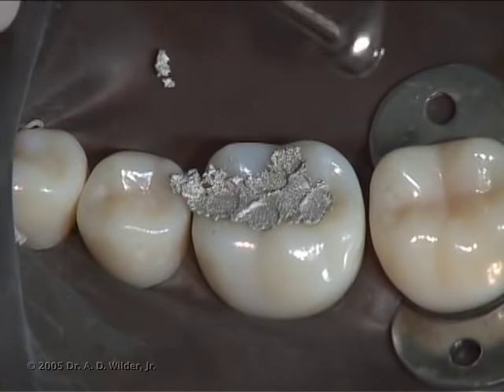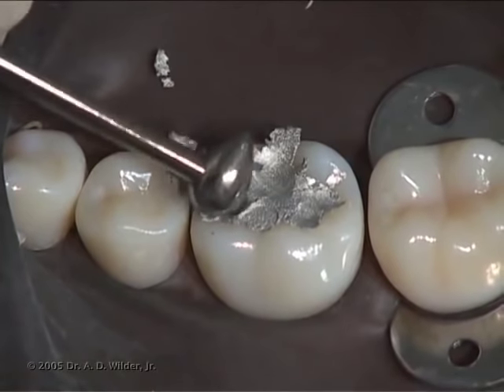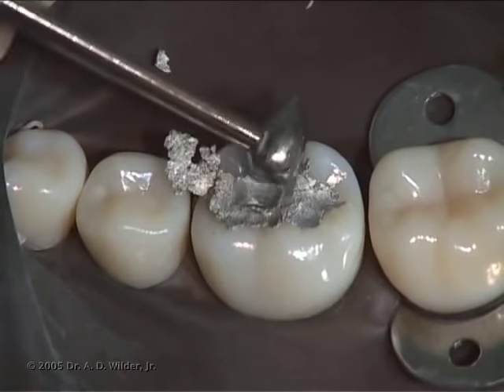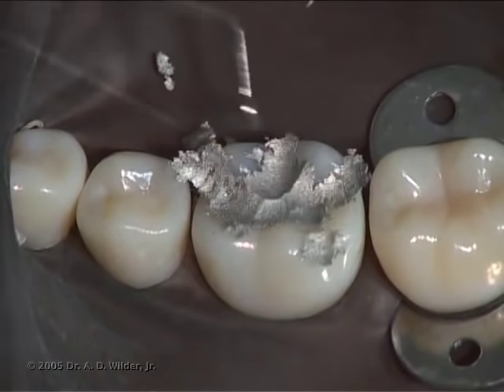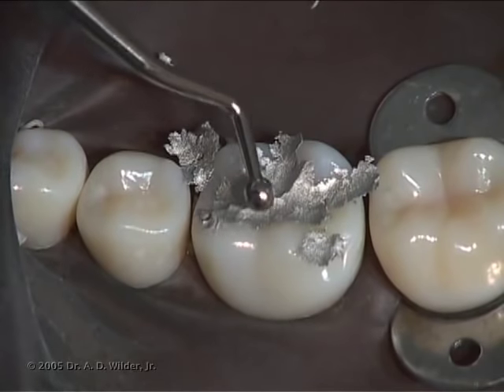With a ball burnisher, you can pre-carve or smooth the surface while simultaneously condensing and removing excess. This helps to form a more cohesive mass while the amalgam is still in a softer stage.